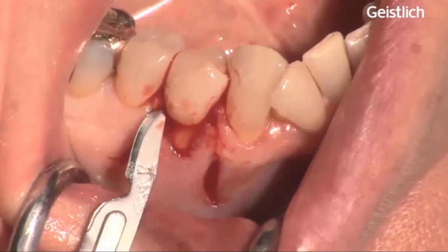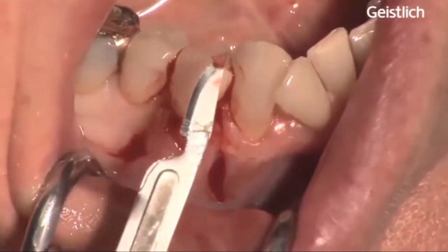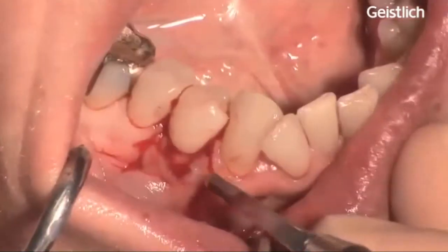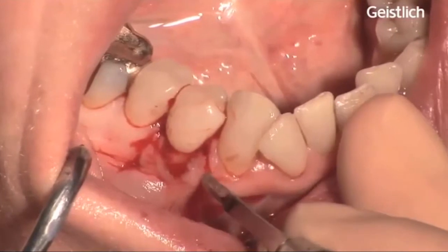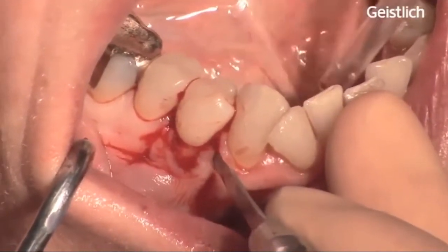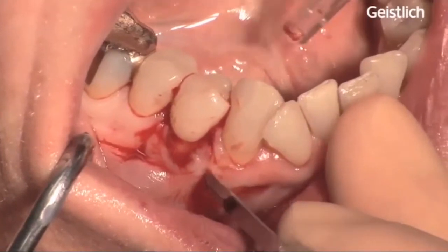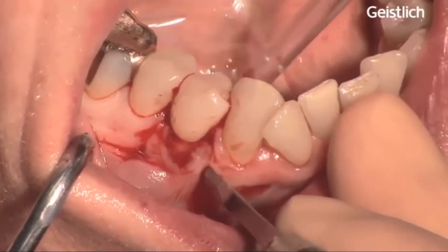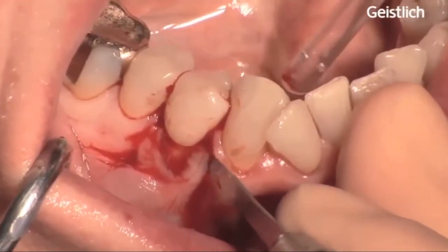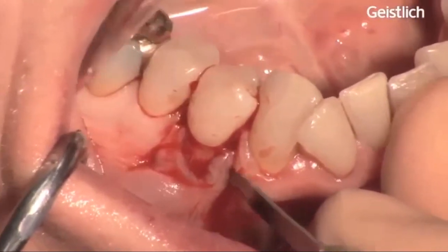The facial portion of the interdental papilla is de-epithelialized to create a connective tissue bed to which the surgical papillae of the coronally advanced flap will be sutured. The two surgical papillae are carefully dissected split thickness.